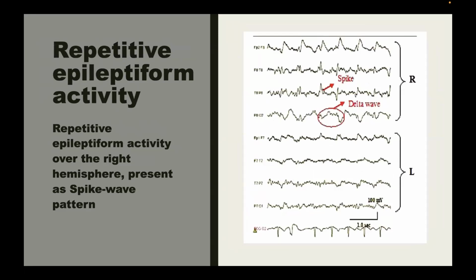It is very difficult because the patient may have the same spike, for example a neurodevelopmental patient with fixed findings, or a patient with a structural abnormality who also has a fixed abnormal repetitive discharge.